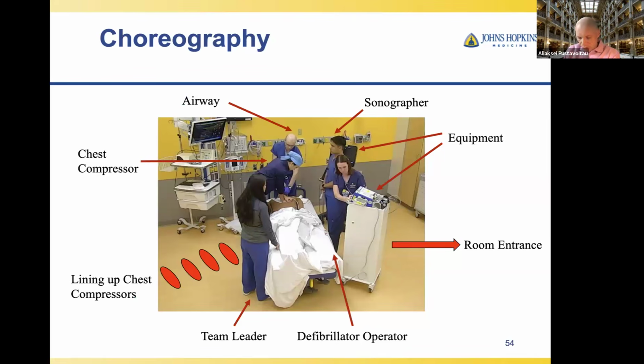Remember, we talked about choreography. In our training, we usually put people into certain places, and every year in the sim center we teach teams. We started teaching ultrasound more and more, although not everyone who attends codes is using ultrasound, and not everyone goes through that training, but our goal is to make it as routine as other CPR training.